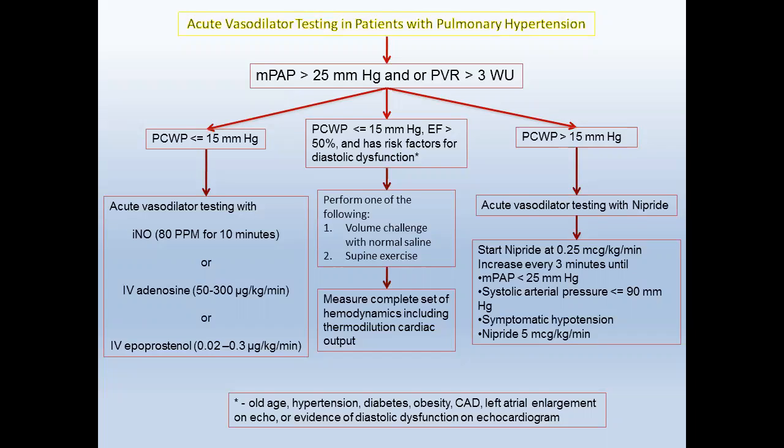Does it have any clinical, meaningful value at this point? No. We don't base our judgment on it. Sometimes, Mark and I would say, the main reason we give nitric oxide, to be honest, in group 3 is that sometimes it even worsens the VQ mismatch. We can make them more hypoxic. So if I give nitric oxide in the lab and they're getting hypoxic right there on the table, I'm not going to give them PA-specific therapy. PA-specific therapy, I don't want to go there because it's an unapproved indication.